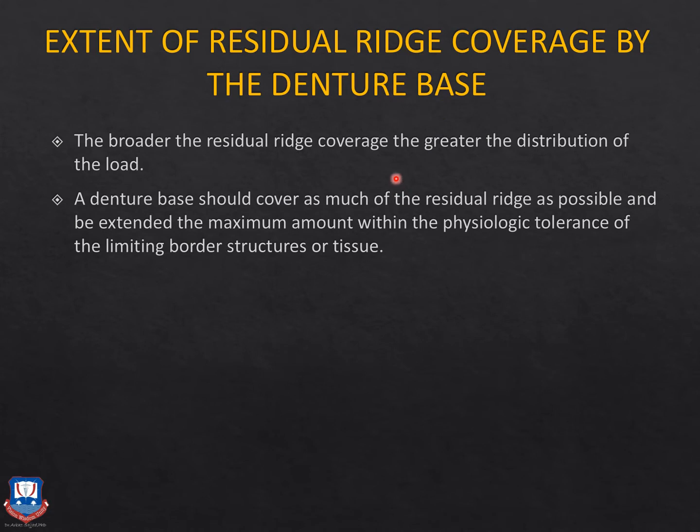The next is the extent of the residual ridge that is being covered by the denture base. The broader the residual ridge coverage, the greater is the distribution of load to the underlying tissues in case of Kennedy's class 1 and class 2.